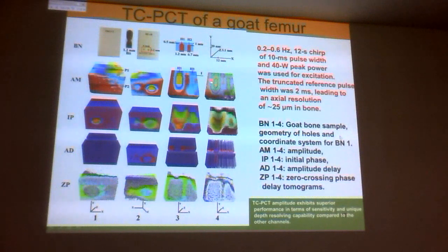And what is interesting about this is that I also see something on top. What that something on top is, is a thermal wave field that is generated above the surface of the drilled area. That is, there is a thermal wave field in the solid, and then there is a thermal wave field right up on top in the air that comes out here. So this is sensitive enough to see the thermal wave field in the air as well.